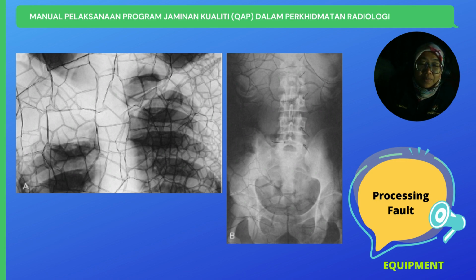Okay, this is an example of processing fault. This does not occur very often. This is very rare, because of the use of old film in X-ray.